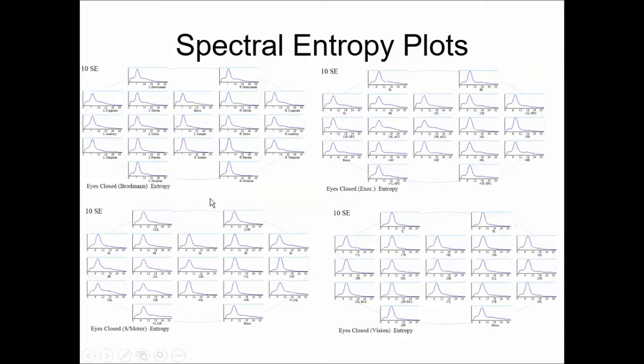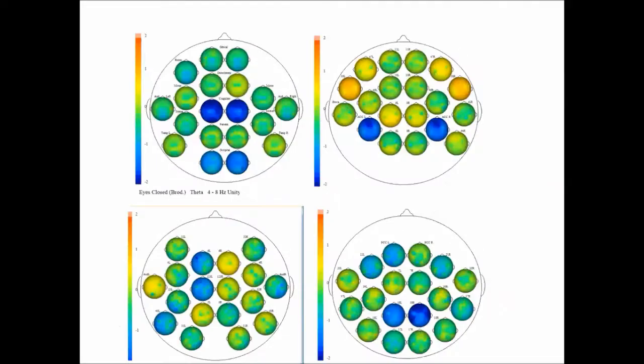And you can see this person giving this alpha peak, the spectral plot, pretty much all the same in most locations. It's an adult in their 50s, actually, so the brain's already hit the maturational maximum in essence. And then we look at the front of the head, the middle of the head, and the back of the head. This one's not that interesting because it's all the same. A lot of times you see a lot more variance going on. But now this is the connectivity.